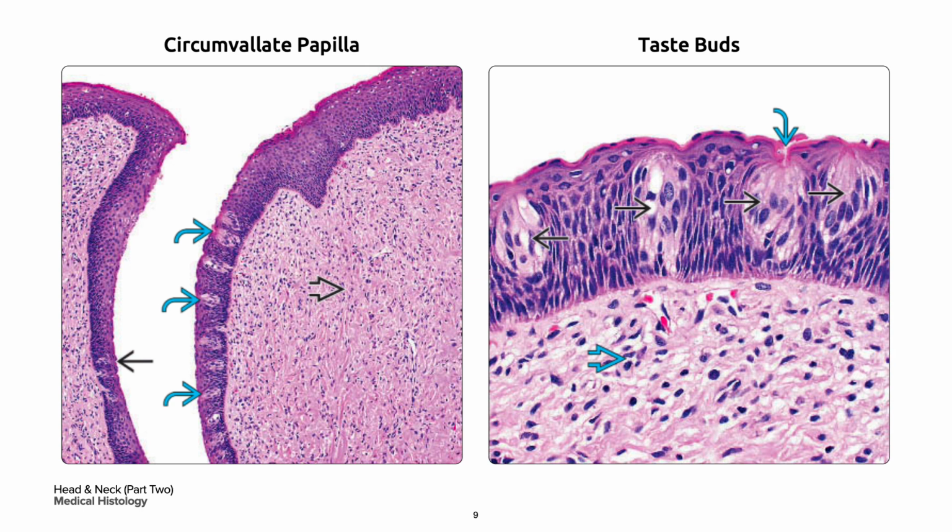On your right are your taste buds. Taste buds are oval, clear-staining structures in single black arrow. They are comprised of crescent-shaped taste supporting and basal cells. A taste pore in curved blue arrow transmits tastes via receptors on the microvilli to the underlying neurites, that is in bold blue arrow.